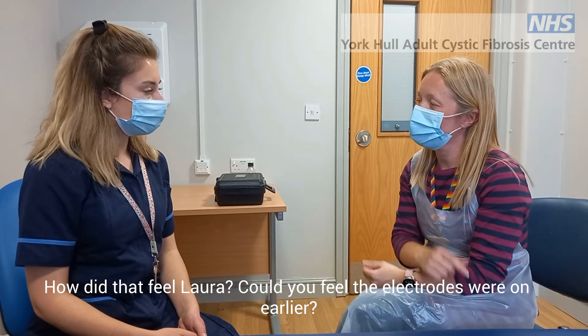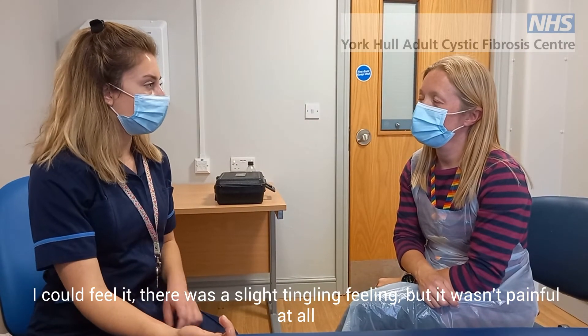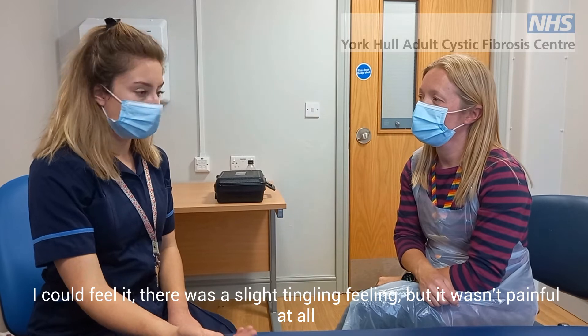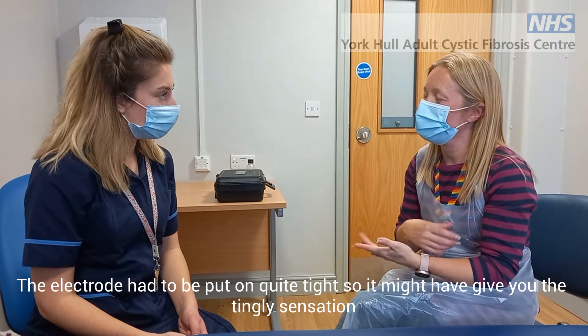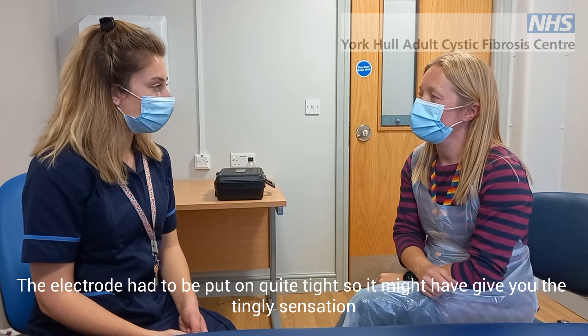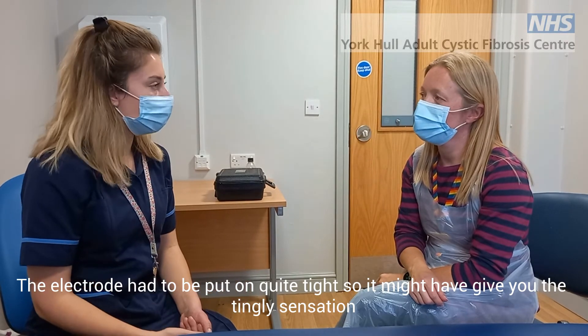So how did that feel, Laura? Could you feel it when the electrodes were on earlier? I could feel it — there was a slight tingling feeling, but it wasn't painful at all and it went as soon as you took it off. And then the collecting device had to be put on quite tight, so again that can be a bit tingly, but it was okay — a little bit tight, but bearable.